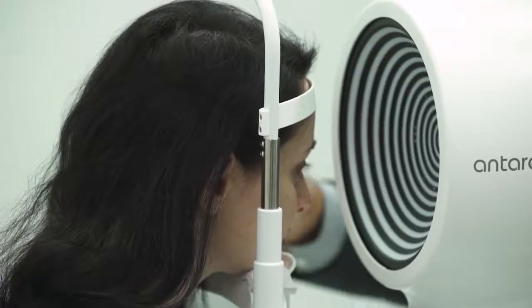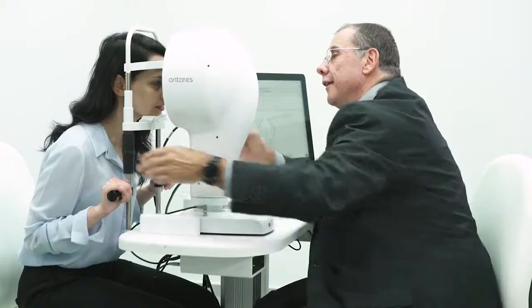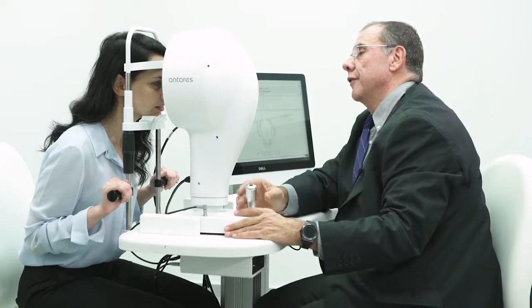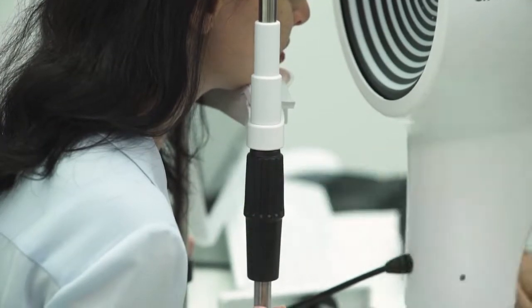On the side that I have got here, there is a line that I'm going to try to line up the canthus of the eye with this particular line, and that will give us the ability to have the correct movement for the machine. And we're adjusting the chin rest with this control on the side.